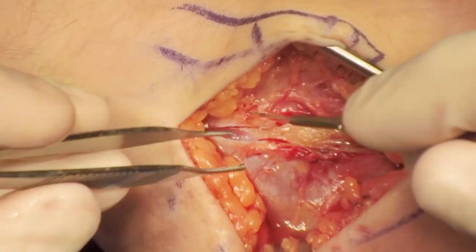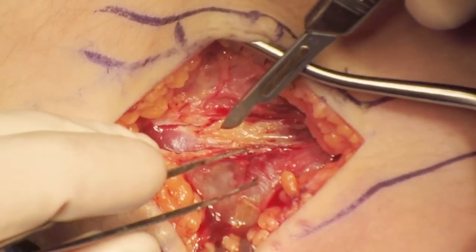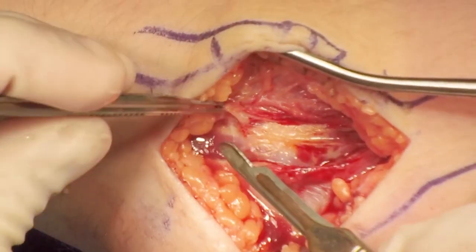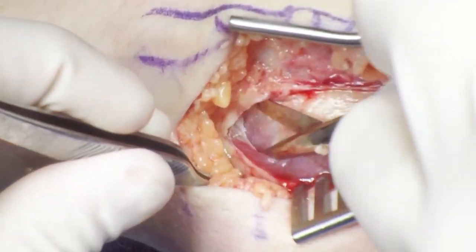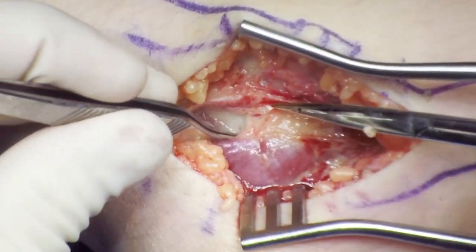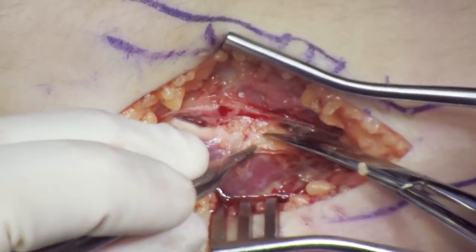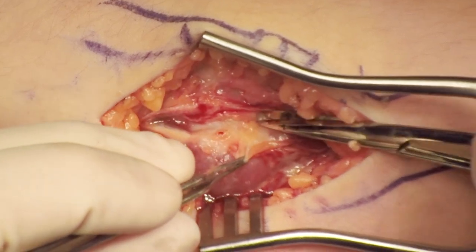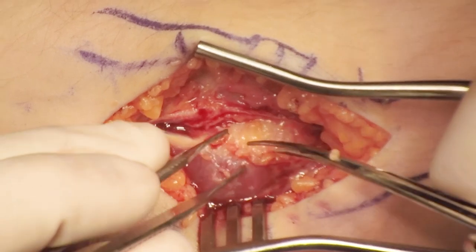The fat stripe is easily identified. Just posterior to the fat stripe is the anconeus muscle. The fascia is elevated a little bit posteriorly as well as anteriorly. The interval between the anconeus and the ECU is developed. I think the Kocher approach is essential for instability surgery. The floor of the Kocher is the LCL — it runs in line with the Kocher. Appropriate identification of the LCL is absolutely critical for repairing instability.